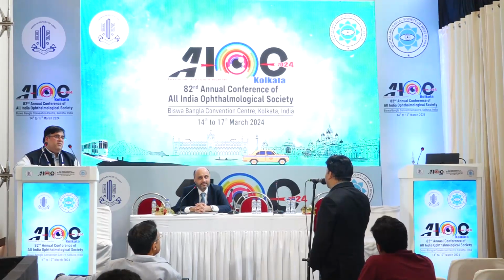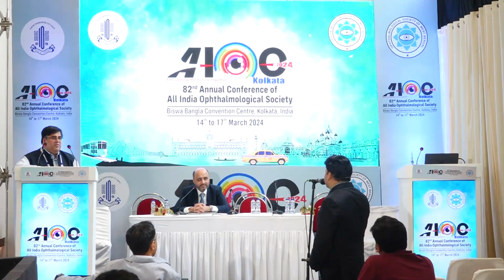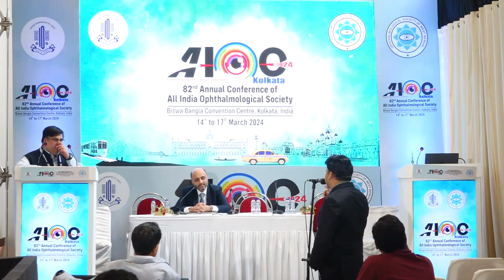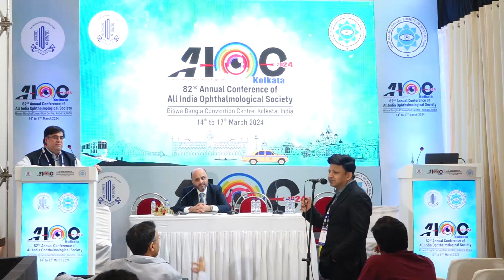So now I've started using TPA before going in again. I inject TPA 2 to 3 hours before the surgery. It becomes lysed and it's easy to remove at that time. But if your retina is detached, stay away, because with open breaks, the lysed blood will go subretinal, and that will cause problems during the surgery.